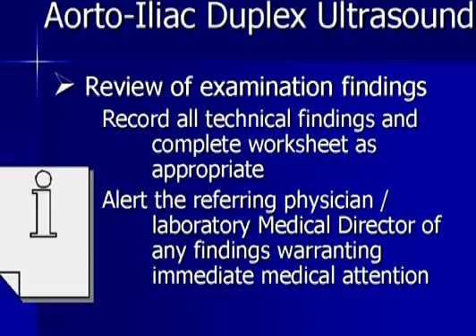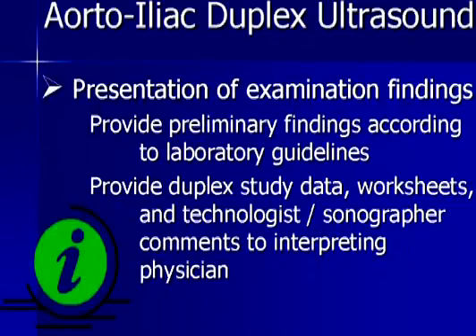You also want to obviously document all of the data you acquired during the examination and record all of your technical findings as completely as you can. If there are any findings that you have that warrant immediate medical attention, be certain that a phone call is placed to the referring physician and possibly your medical director as well, so that these actions can be implemented in a timely fashion in the interests of good patient health and safety. You then have to present all of these findings to the interpreting physician.